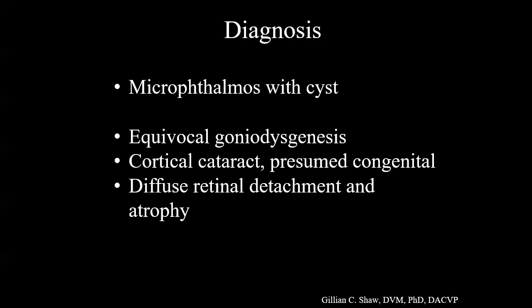But when it's larger, and also depending when it happens during the embryology of the eye, you might end up with a larger defect that creates a weakness where vitreous and aqueous gets access and causes that cystic lesion, and the embryologic retina keeps developing and following that cyst line.